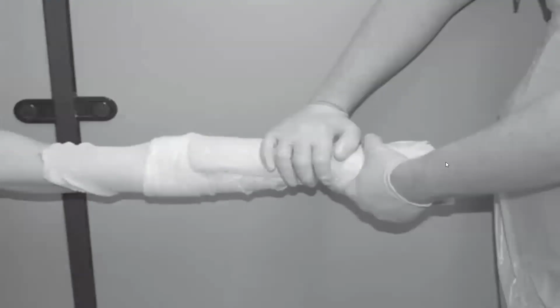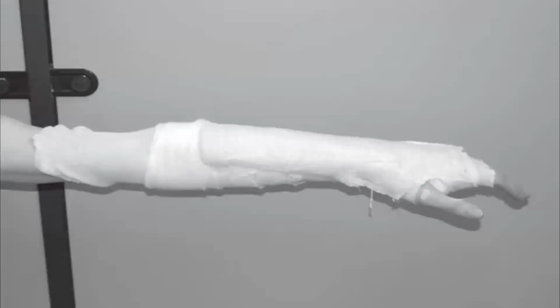Then I will make 6 to 8 layers of the bandage. Then I will place it in warm water and squeeze it to remove excess water. Then I will apply it from the metacarpophalangeal joint, on the dorsum of the hand, while the forearm is extended and pronated.